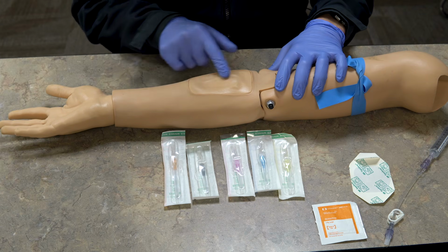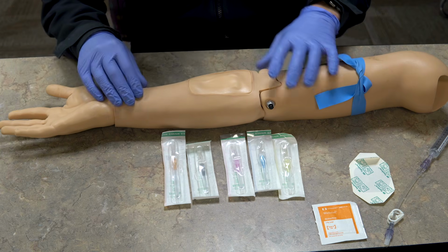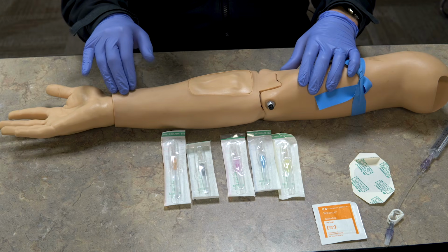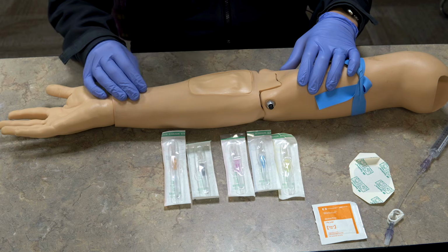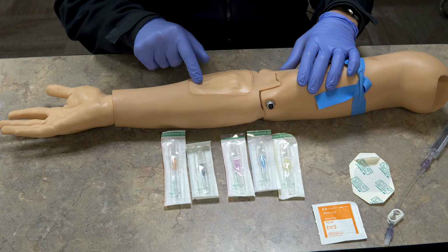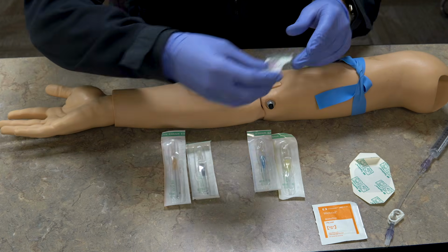You want to determine the direction of the vein because that's going to determine what angle your catheter is at. Generally speaking, things are going to be going right along the arm here, but you will have veins that are off to the side, and it's just important to get the angle of the catheter when you start. So in this case, I've got a vein right here, and that's what we're going to go with. So for this, I'm just going to be starting it with a 20 gauge IV.